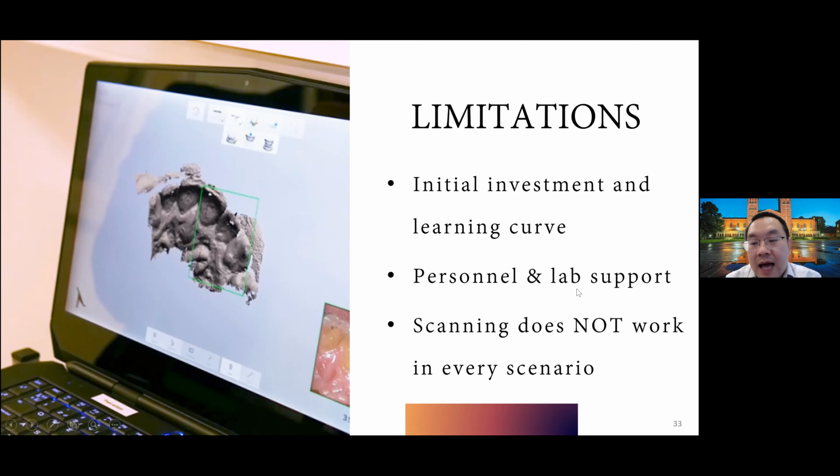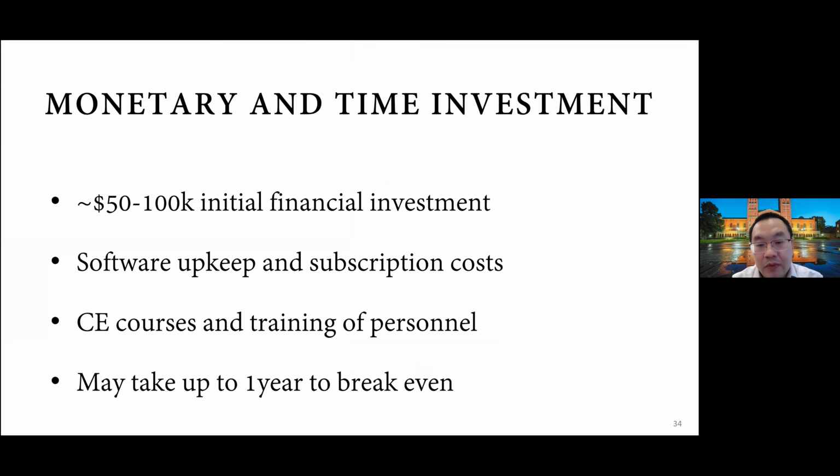In terms of personnel and lab support, you need to find a lab that is going to work well with you. And you have to train your personnel to do the scanning. Most likely it's not going to be the dentist who does the scans, especially if you're talking about an orthodontics workflow. But for your final impressions, you might want to scan it yourself. For all the pre-op scans, the intraoral scans, or periodic exam, the routine scans, your assistant should be able to do it. You have to train them to do that. Scanning does not work in every scenario, and we'll talk about that a little bit more, right?